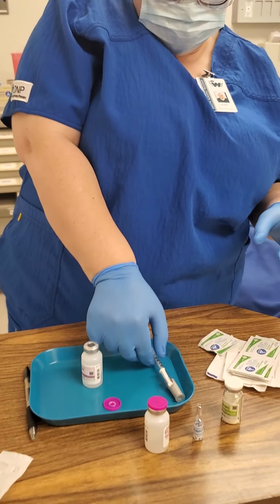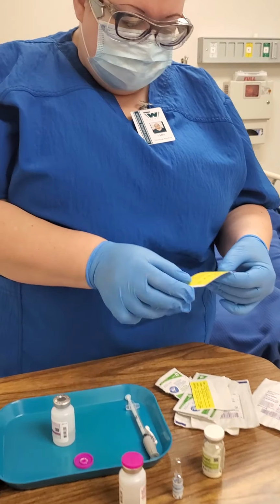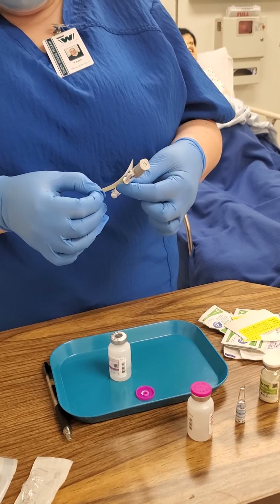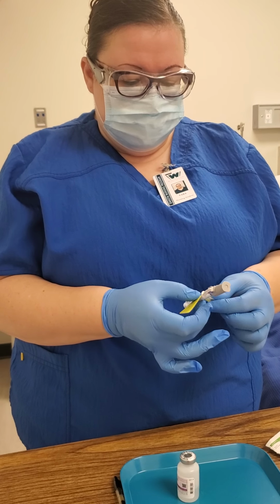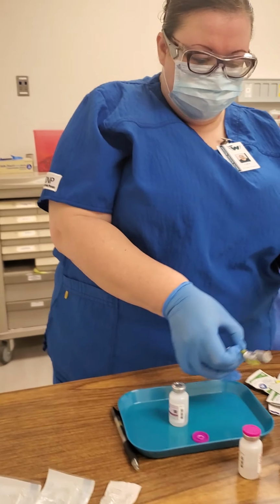Recap that. And then I'm going to get my sticker for that. I have tuberculin on there and 0.1 milliliters, and my initials and then the date and the time that I'm giving it. So it'll be 10 a.m.